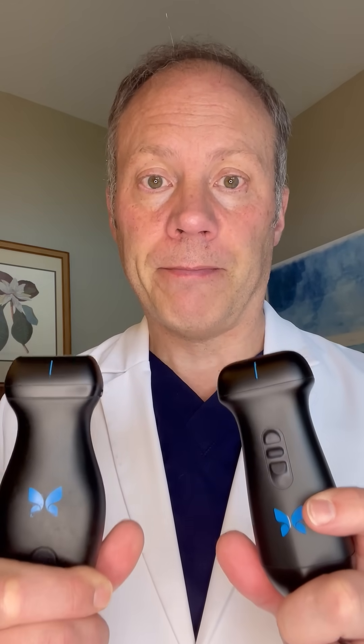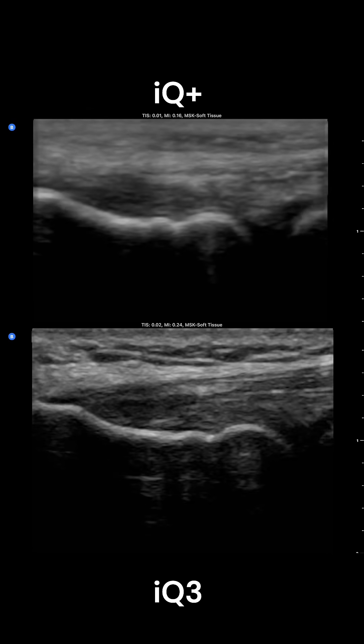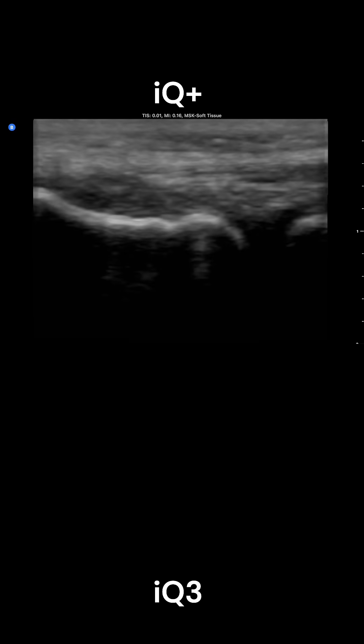Musculoskeletal, vascular, small parts — they have now increased the frequency all the way up to 12 megahertz, which is pretty comparable to most linear probes you'll find on the market, and it has made a big difference in terms of image quality over the old IQ+. Here's a common extensor tendon on the same patient. You can see the IQ3 on the bottom is much sharper and more detailed.